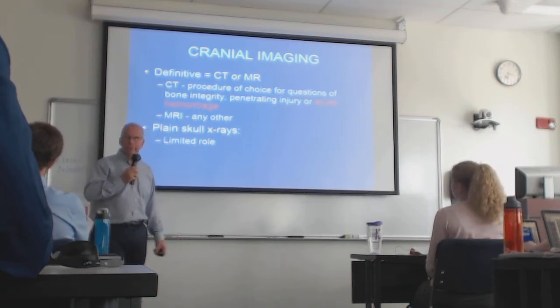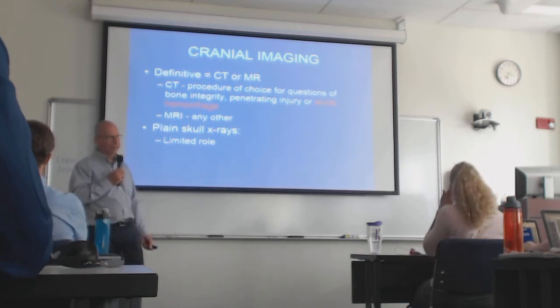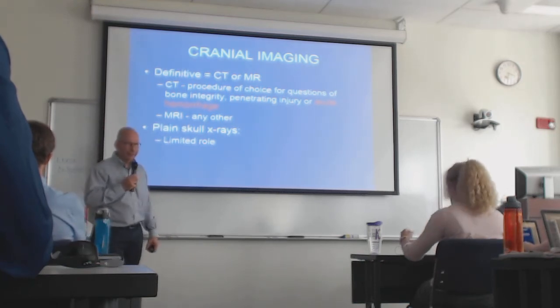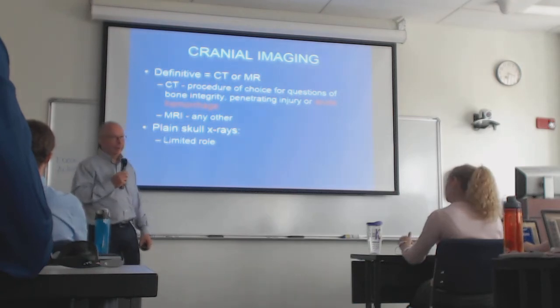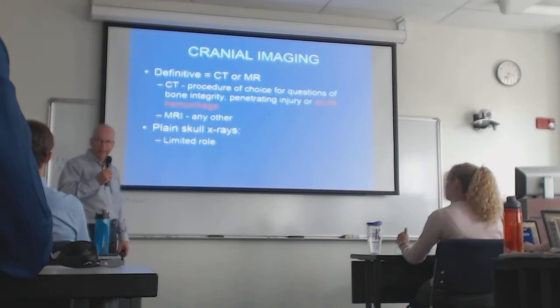MRIs take longer to do. When someone is suspected of having intracranial hemorrhage, time is of the essence. You want to diagnose it, you want to fix it. MRI can take 40 minutes. You know, CT can take 30 seconds. So that's definitely where you want to go.